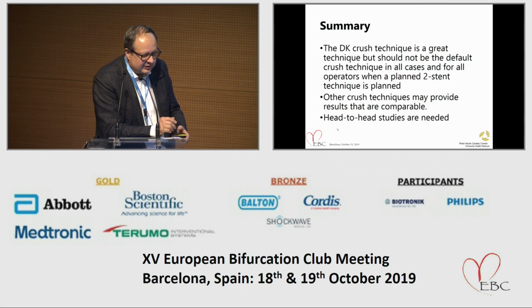So in summary, the DK crush technique is a great technique, but it should not be the default crush technique in all cases and for all operators when a planned 2-stent technique is needed. Other crush techniques may provide comparable results, and head-to-head studies are needed. Thank you.